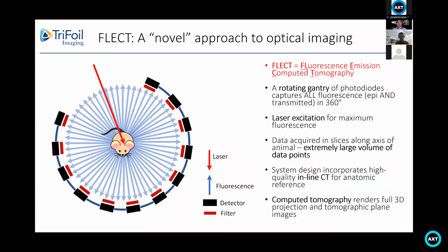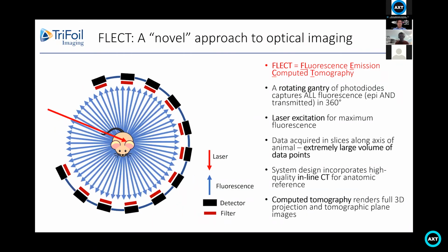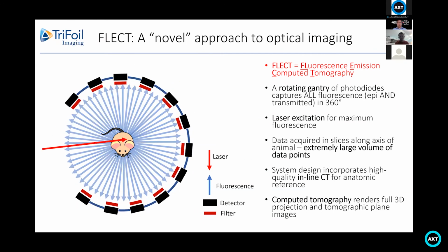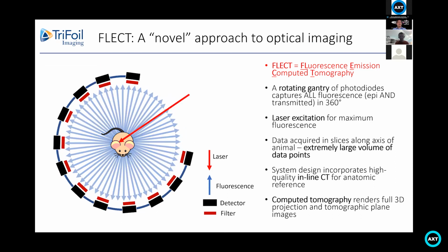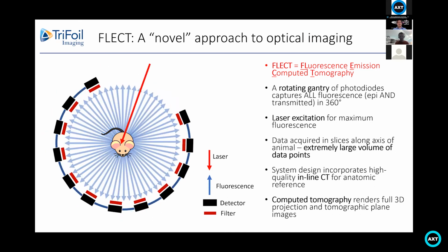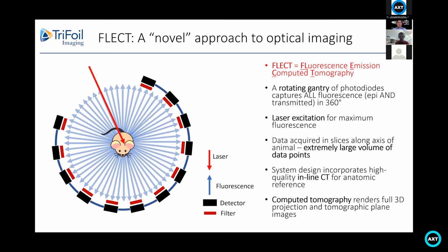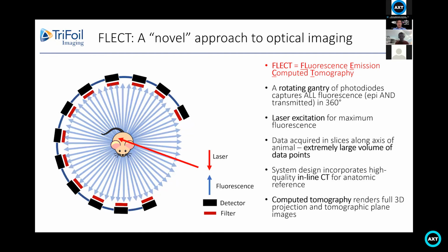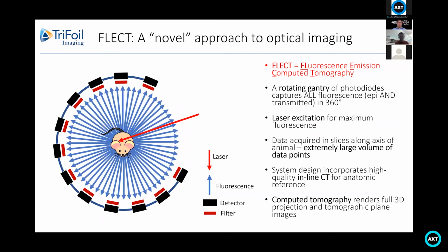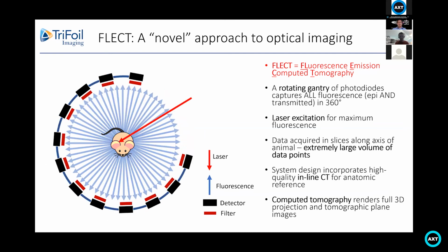In addition to this, both the X-ray CT and the optical components are mated onto the same gantry. I also need to reiterate that acquisition is done one at a time, meaning one sequence of data is taken at a time instead of both simultaneously. But this allows us to view the animal from anatomic reference, getting a nice X-ray CT, and then interrogating over the specific area of where you want to look at for your optical signal.